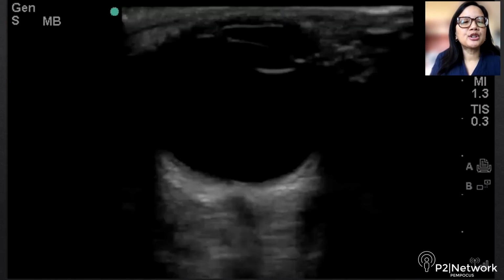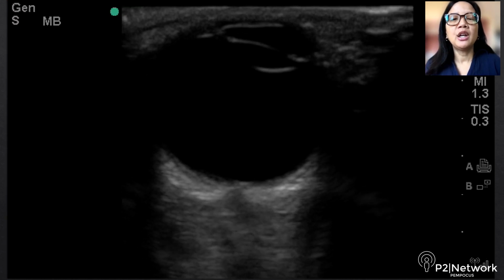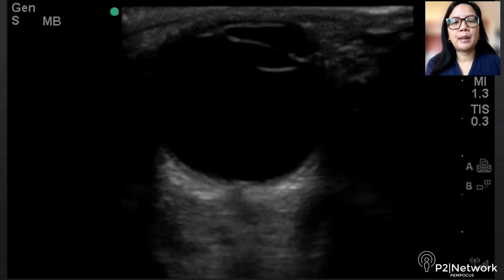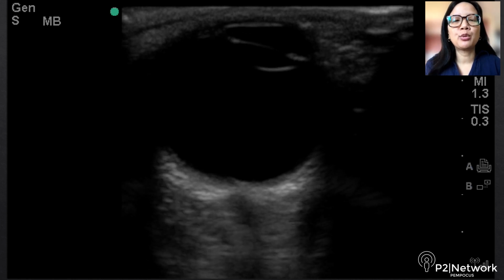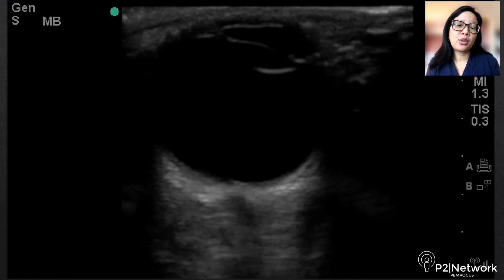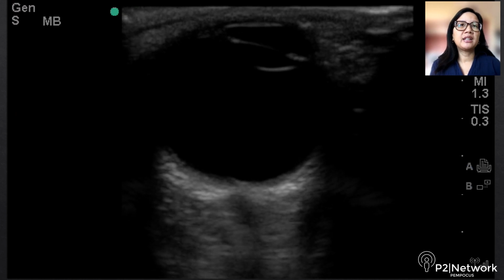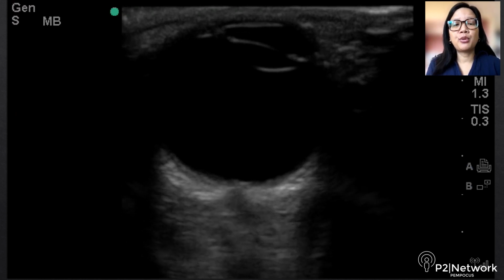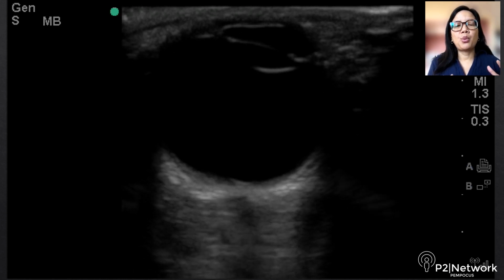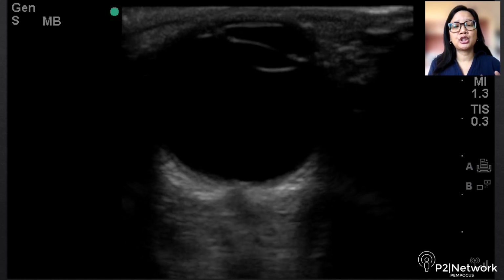So when we first started doing ocular ultrasound and measuring optic nerve sheath diameter using point of care ultrasound, I think almost all of us visualized the optic nerve as this hypoechoic structure entering the retina close to a right angle. However, as we're doing these ultrasounds more and more, and as we're doing these ultrasounds more in children, there's been a shift in our understanding of what is truly the optic nerve on ultrasound and what's shadowing created by either the lamina cribrosa or acoustic shadowing.